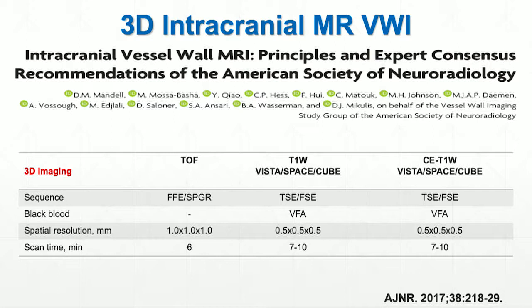One thing that is fairly common in vessel imaging is that contrast enhancement plays a very key role, because it can help you identify this so-called intraplaque hemorrhage. So the enhancement is very useful. And for intracranial vessel imaging, the enhancement is even more useful because it may help you identify so-called inflamed arteries, such as in vasculitis, where the enhancement pattern itself becomes critical information.